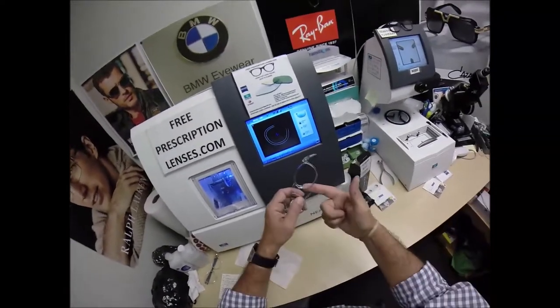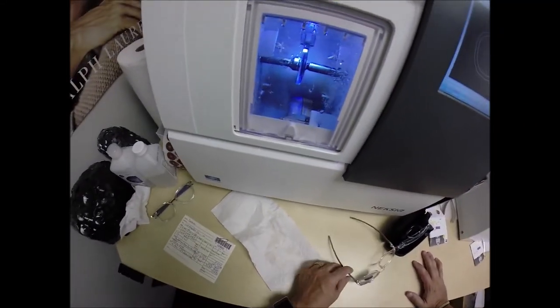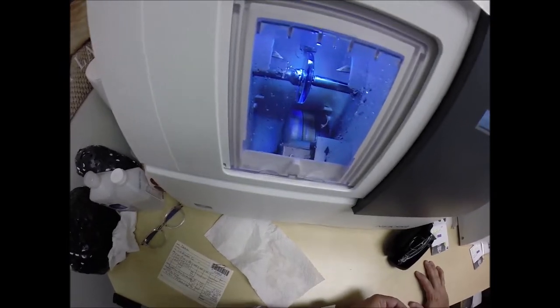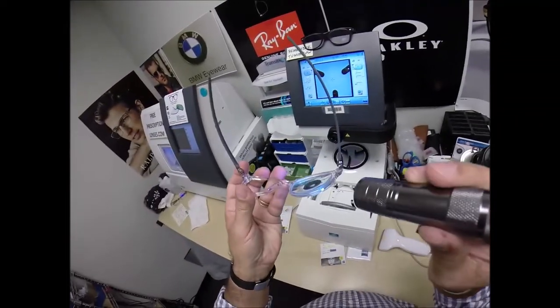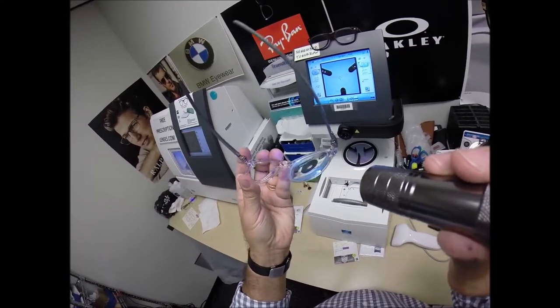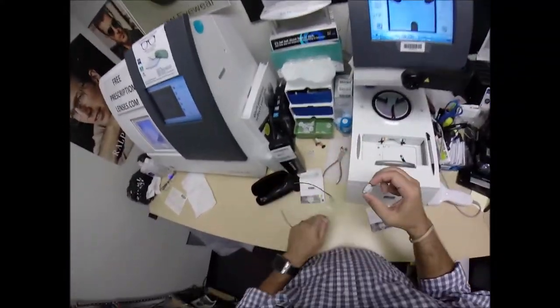And you can see it's tracing the shape of the left side. Ding! Turn the page. And then again, measuring the thickness of the lens at every point to know exactly where to place the bevel so you have the least amount of edge thickness showing. Look at that, you barely have any. And the cool thing is, because it's a crystal color frame, it's almost the same color as your lens. Nobody's going to see that.